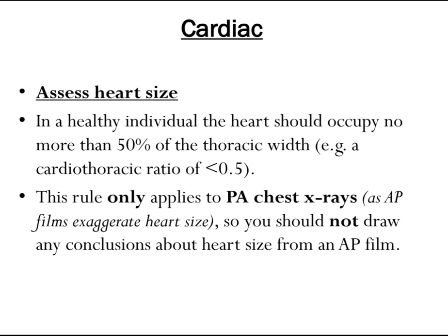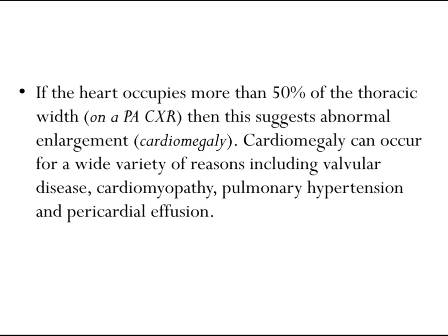C is for Cardiac. Assess the heart size — in a healthy individual the heart should occupy no more than 50% of the thoracic width, giving a cardiothoracic ratio of less than 0.5. This rule only applies to posterior-anterior chest x-rays, as anterior-posterior films exaggerate heart size. If the heart occupies more than 50% of the thoracic width on a posterior-anterior film, this suggests cardiomegaly, which can occur for a wide variety of reasons.